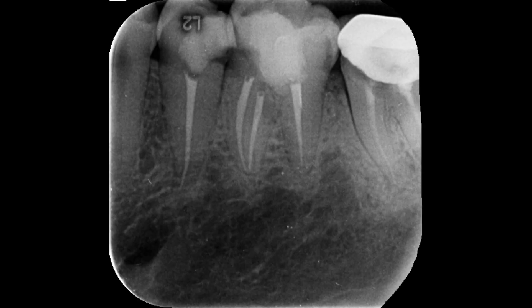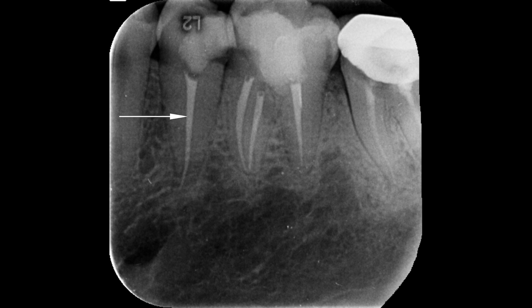This is the final radiograph — the distal view — where you can see all three well-prepared canals in the mandibular first molar tooth. This is the mesiobuccal canal, this is the mesiolingual canal, and this is the distal canal. In the mesial root you can see the two separate canals which end into two separate foramens. And in the second premolar tooth, this is the single well-obturated canal.